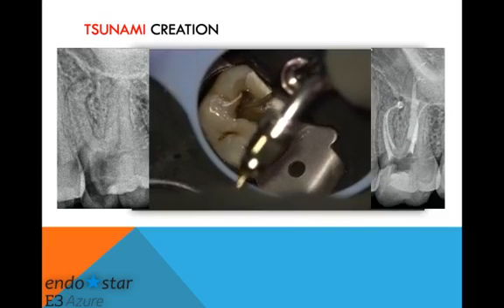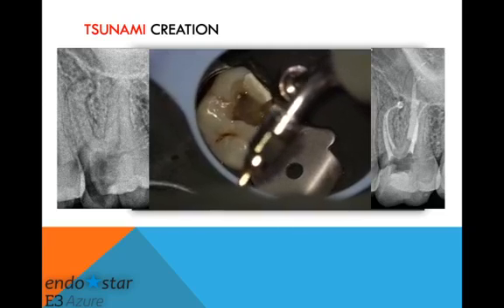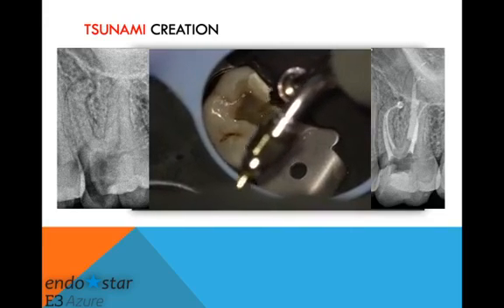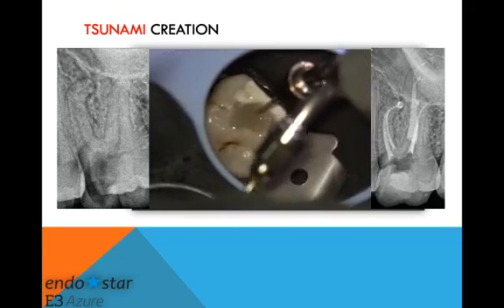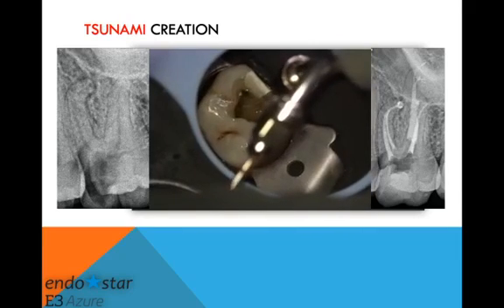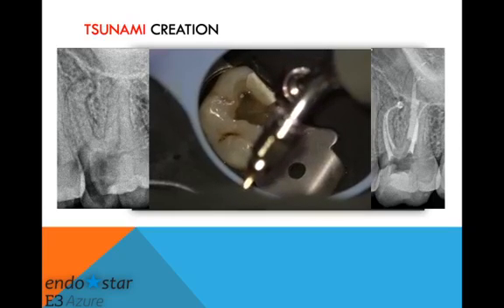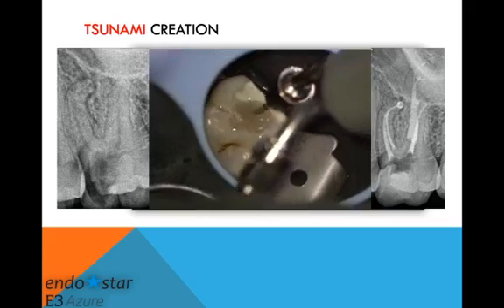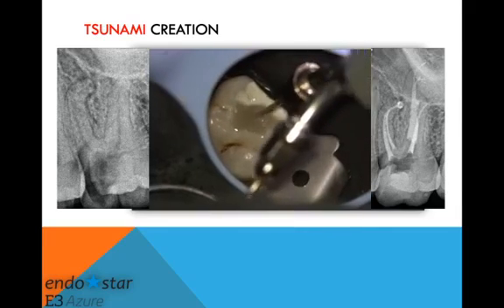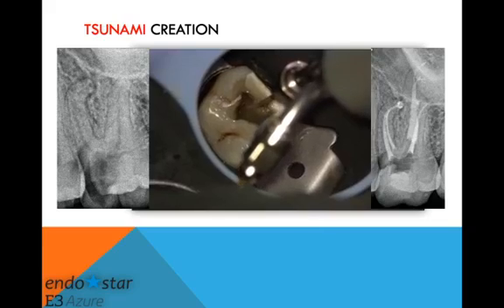Therefore, as you can see with the ultrasonic tip, the transparent sodium hypochlorite that was there has now turned turbid. So imagine the amount of smear layer, the bacterial byproducts, etc., that are being removed by activation of this irrigant. And eventually all of this that has been liberated out of the canal will get flushed out. There you go.